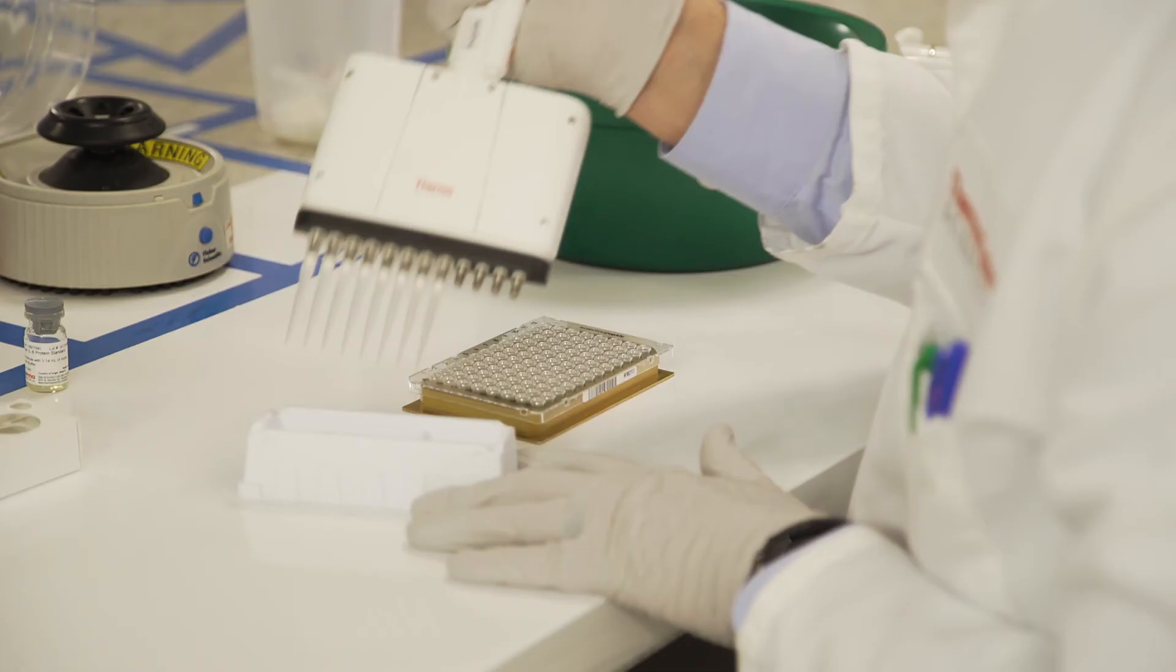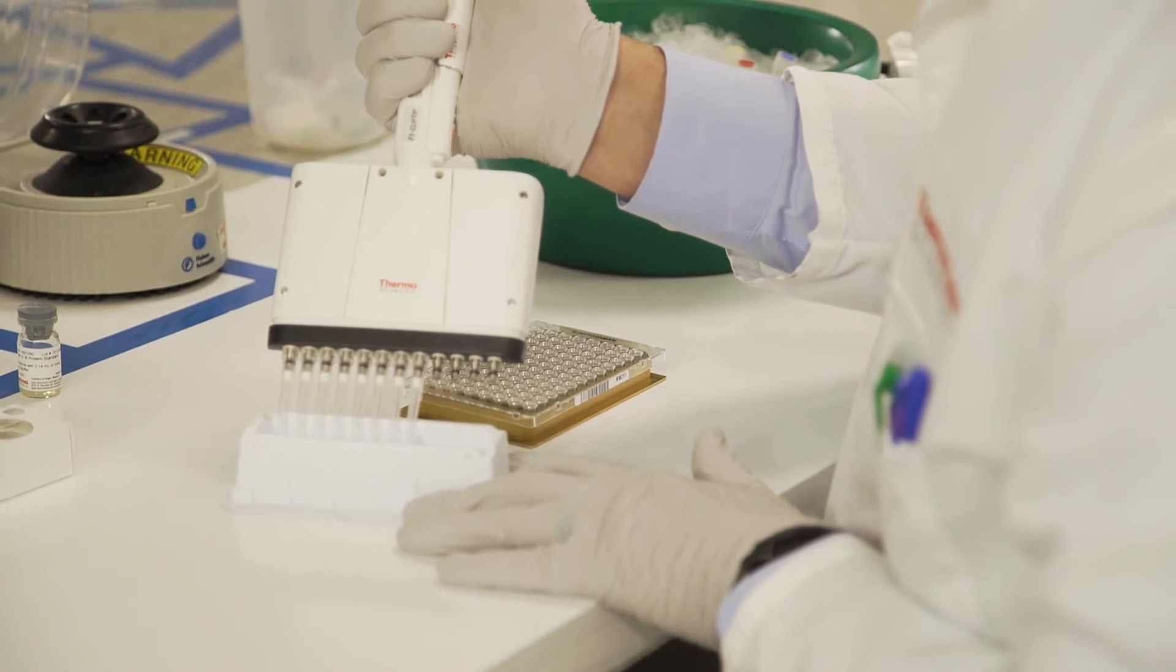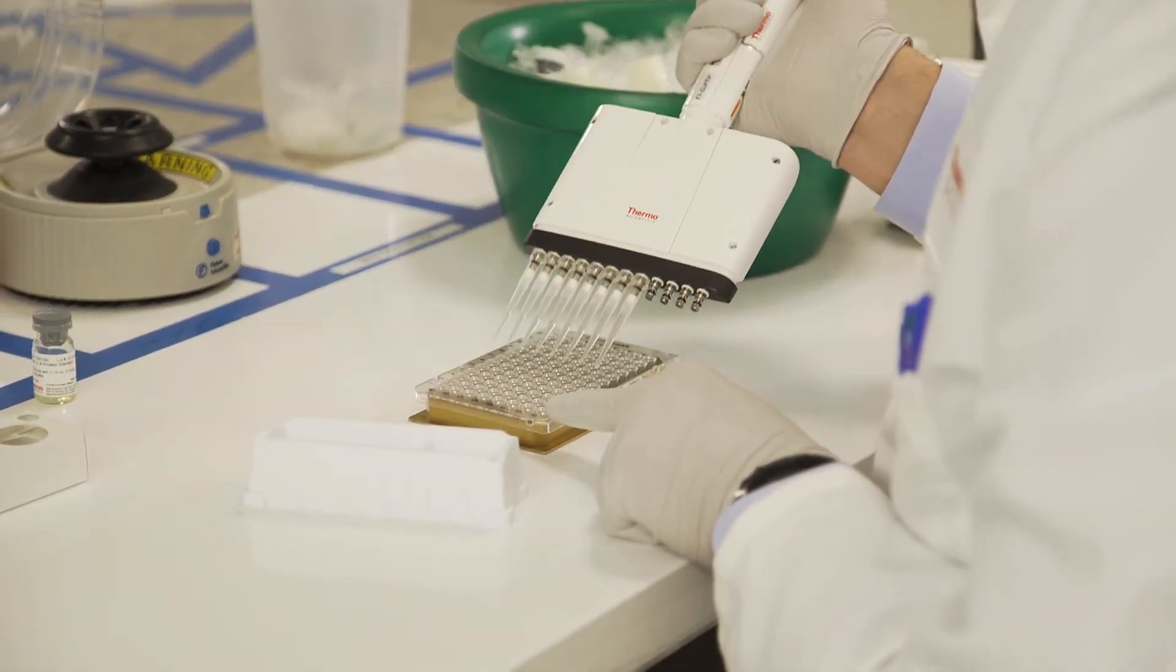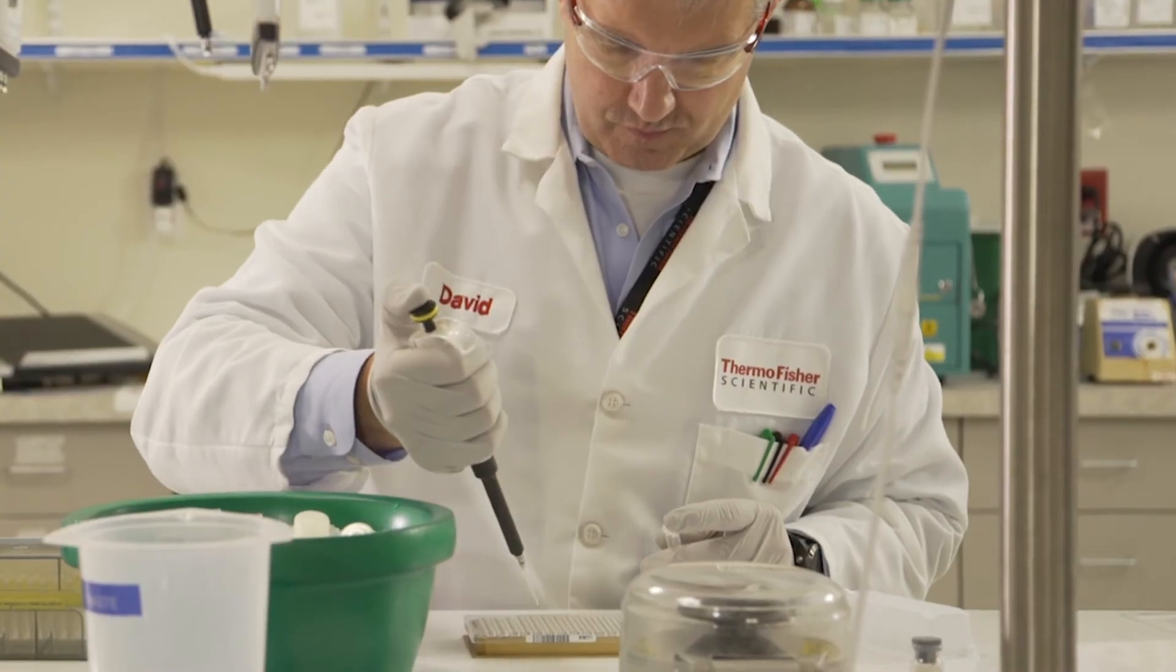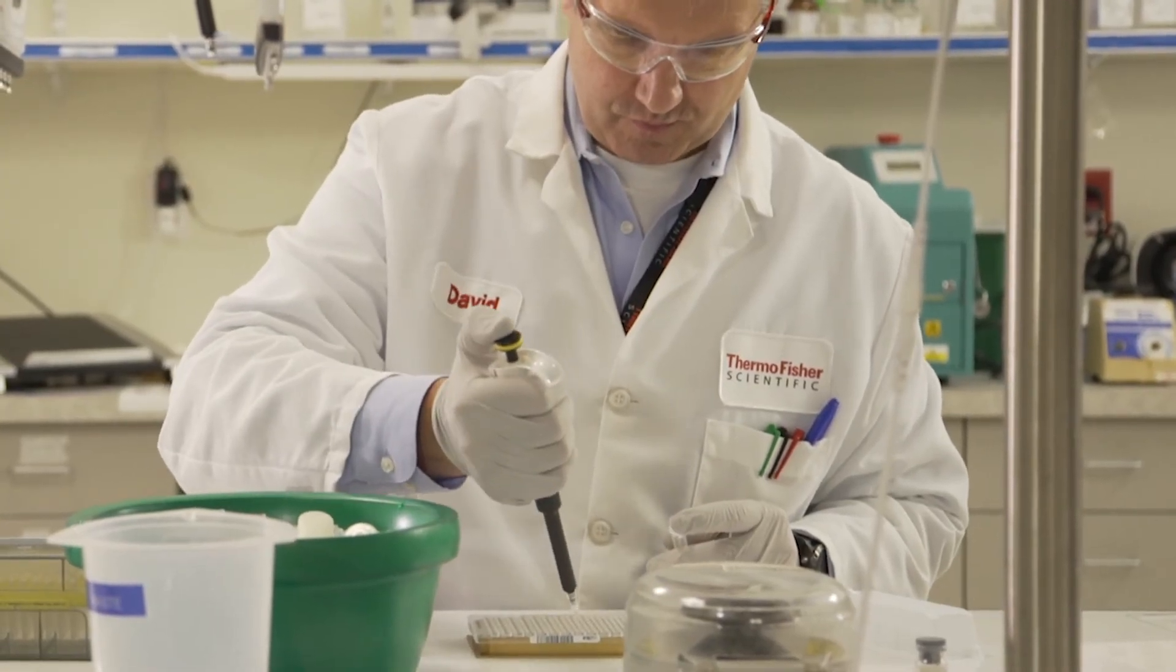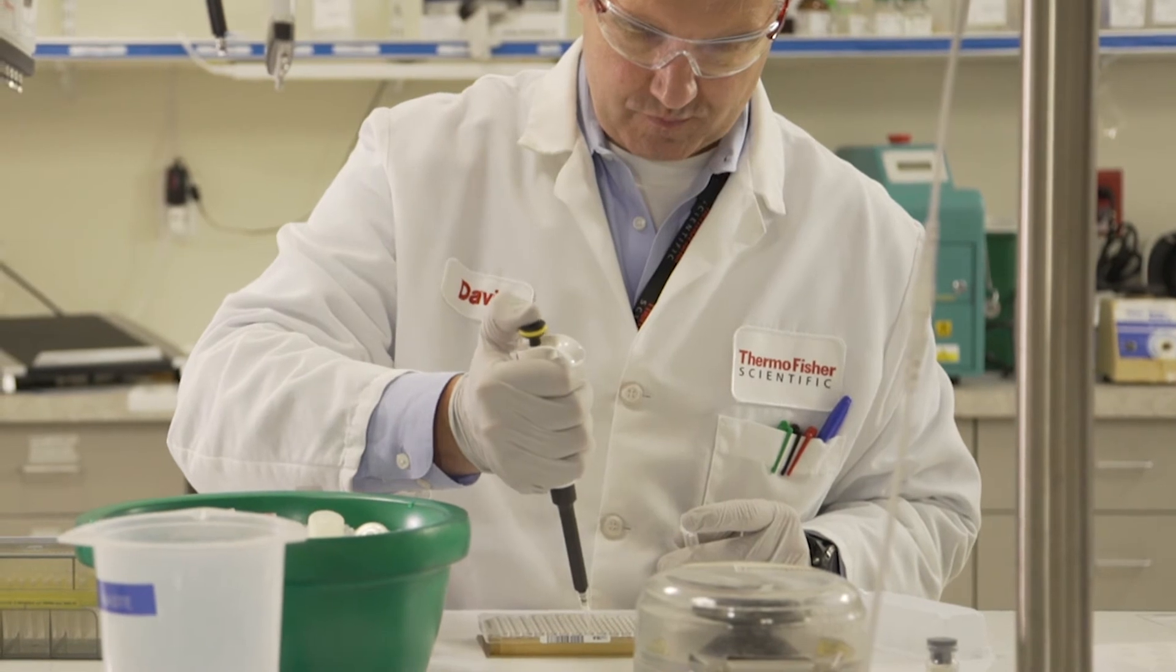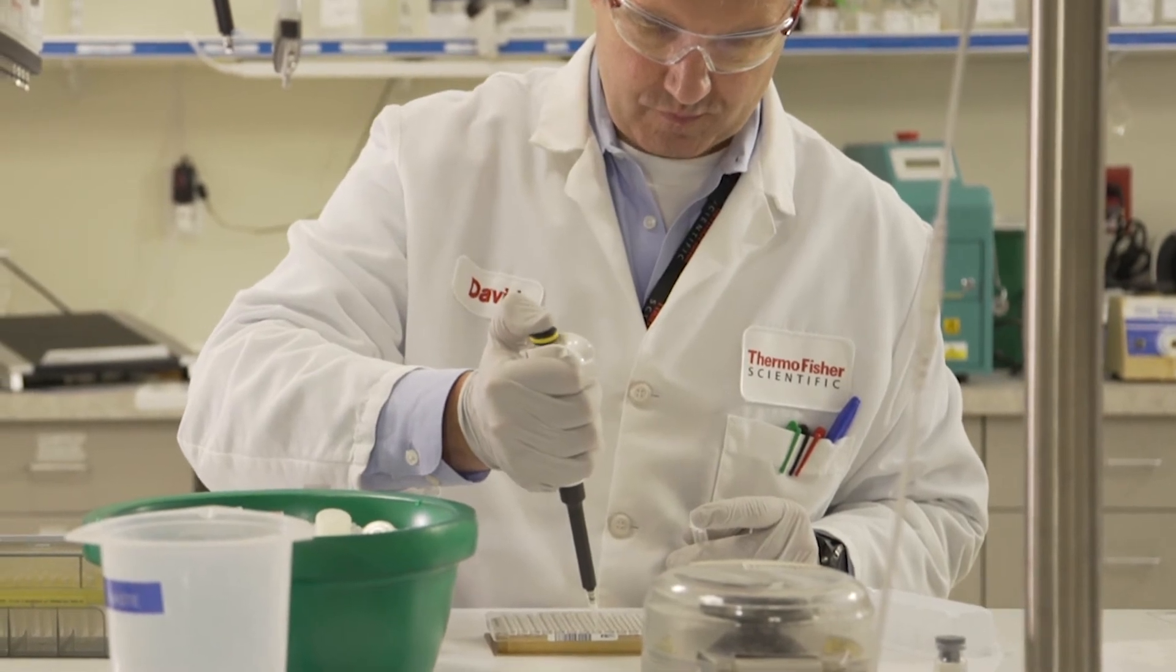Next, dilute your samples tenfold. Dispense 45 microliters of assay dilution buffer to the wells reserved for the unknowns. Then pipette five microliters of your sample, making sure to carefully mix by pipetting up and down before discarding your pipette tip.